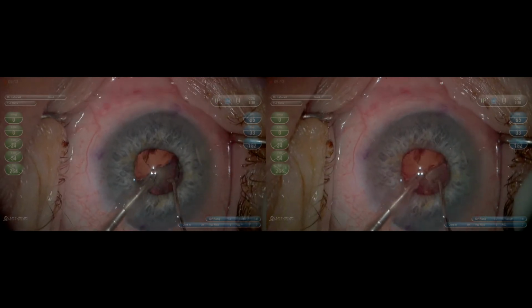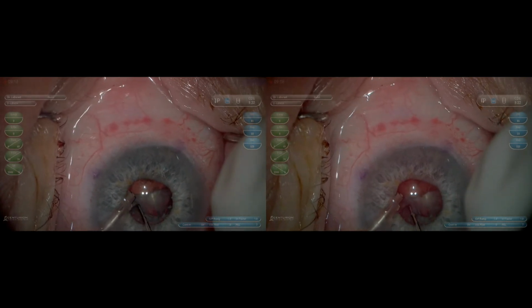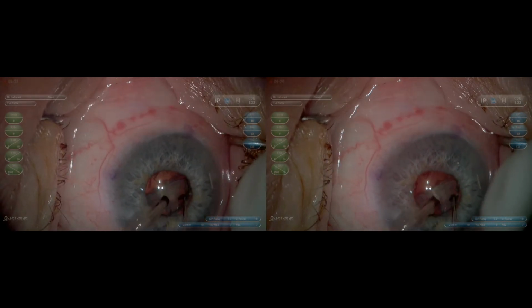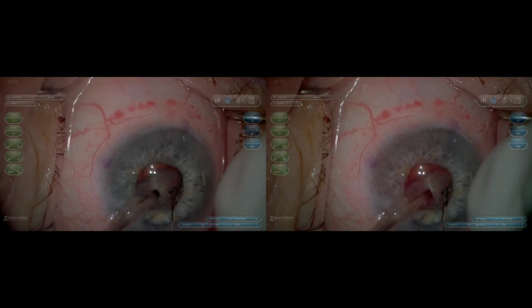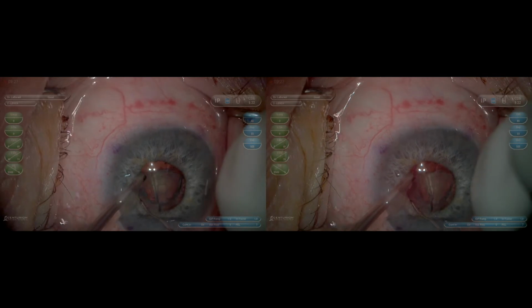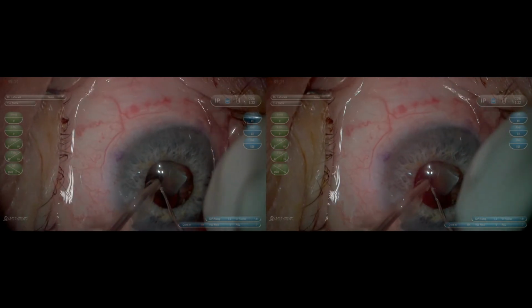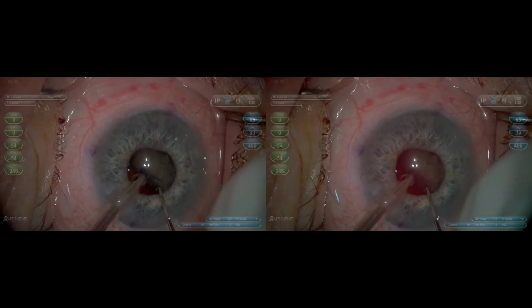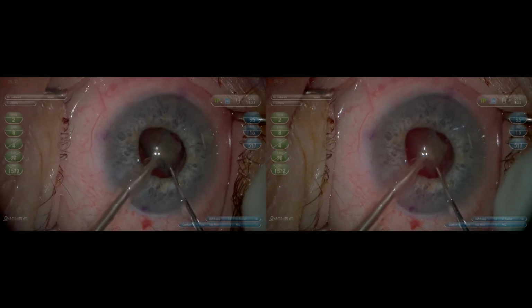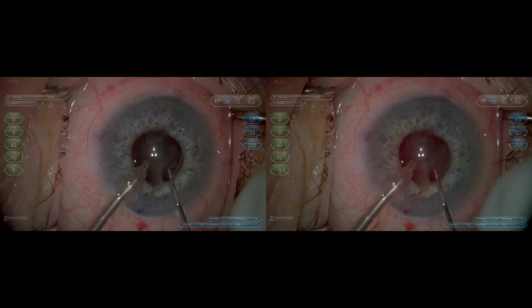In this case, I utilized a femtosecond laser to leverage the technology to allow me to remove a central bowled out area that is deep within 500 microns of the posterior capsule, and then the chop pattern creates 4 equal quadrants that can then be pulled into that bowled out area and removed within the nuclear bowled out area, which is within the bag far away from the cornea.